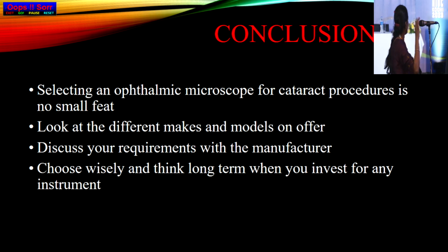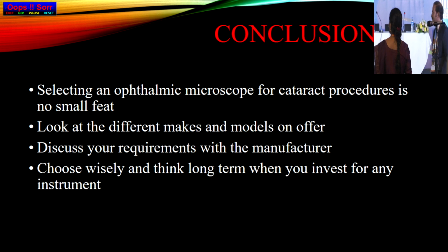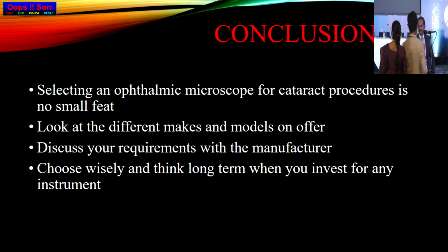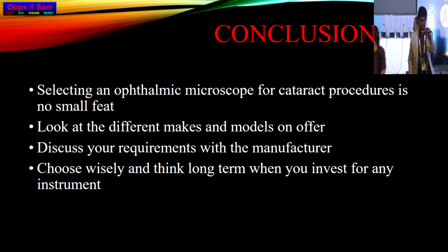For microscopes, I think it is usually not needed because nothing usually goes wrong for the first 5 years at least, except for the bulbs that we have to maintain and a regular service. I think for phaco machines and vitrectomy machines, it's required.